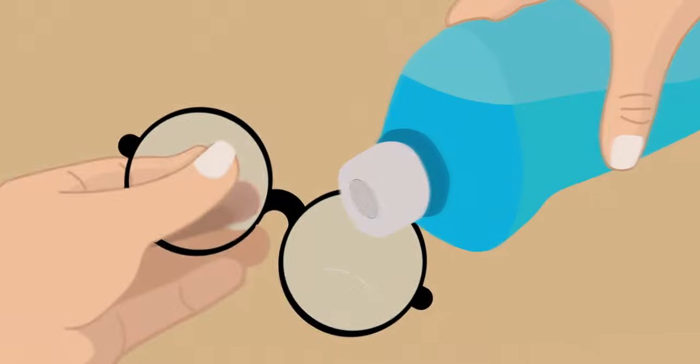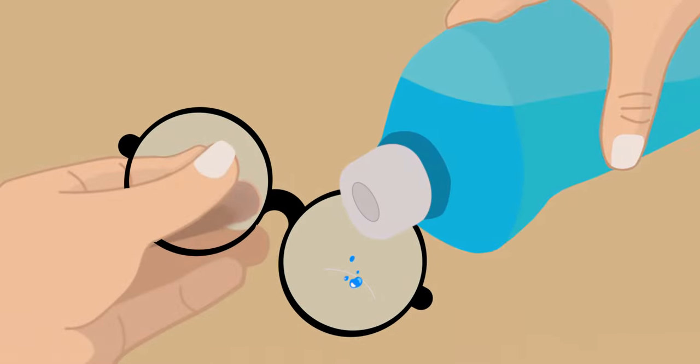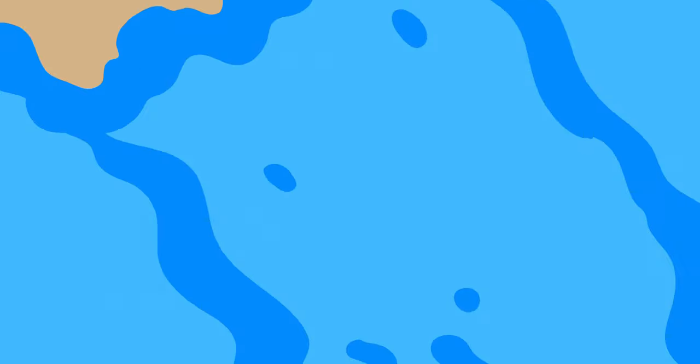Now, if you're dealing with deeper scratches, we have another trick up our sleeves. Grab a cotton ball and some glass etching cream. Apply a small amount of the cream to the scratched area and let it sit for a few minutes. Then rinse it off with water and dry your glasses with a clean cloth.